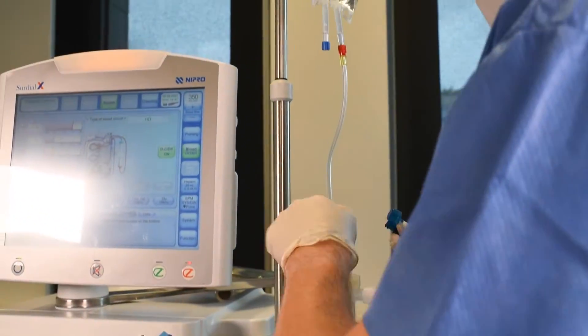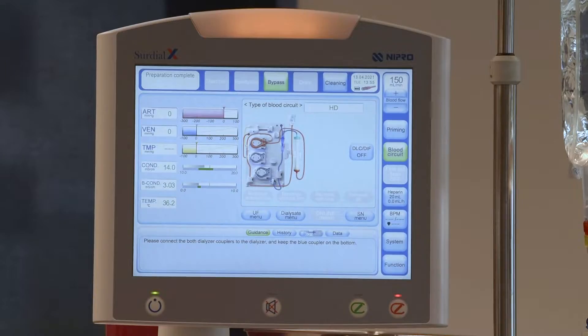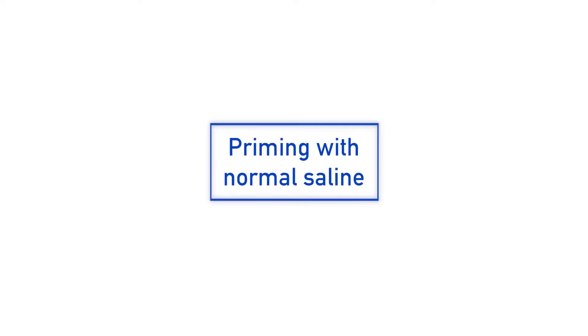Attach the venous line to the dialyser. When the machine is ready for priming, the yellow light will start blinking and the user is asked to attach the couplers to the dialyser.